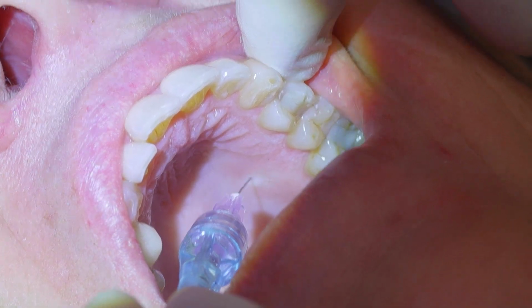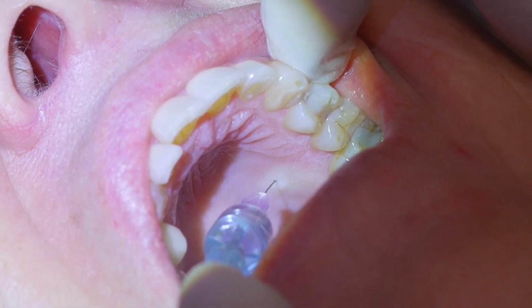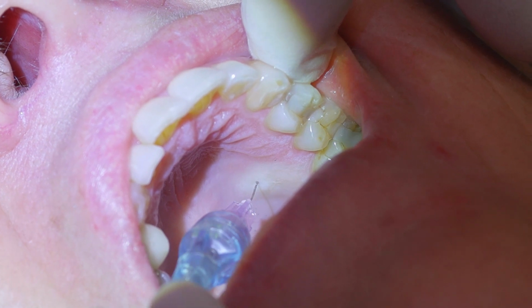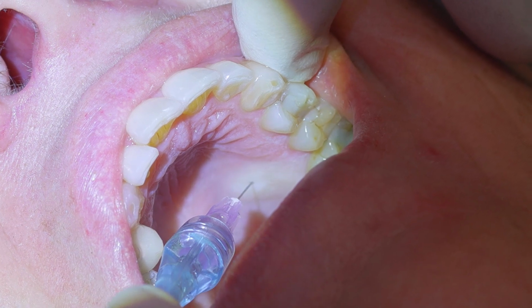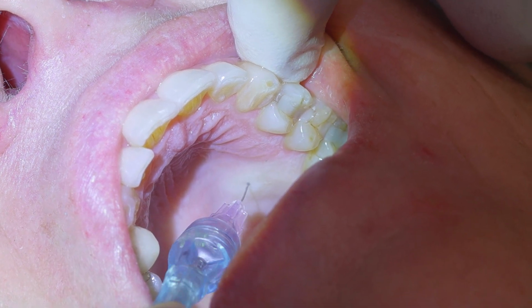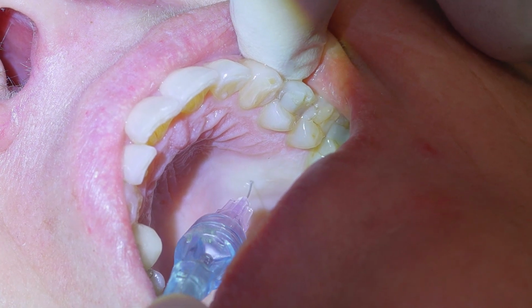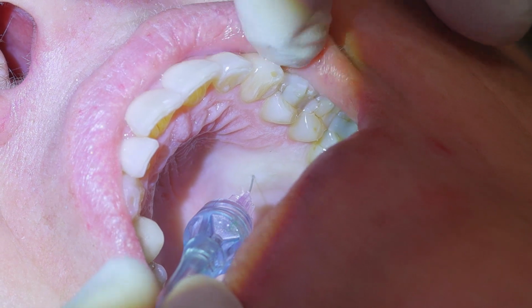You all right? Mm-hmm. When doing the AMSA injection, to keep the discomfort to a bare minimum, we use a technique called birotational movement, and then I'm slowly moving it into the tissue, the hard palatal tissue. And actually what we're doing is we're slowly doing this and rotating.